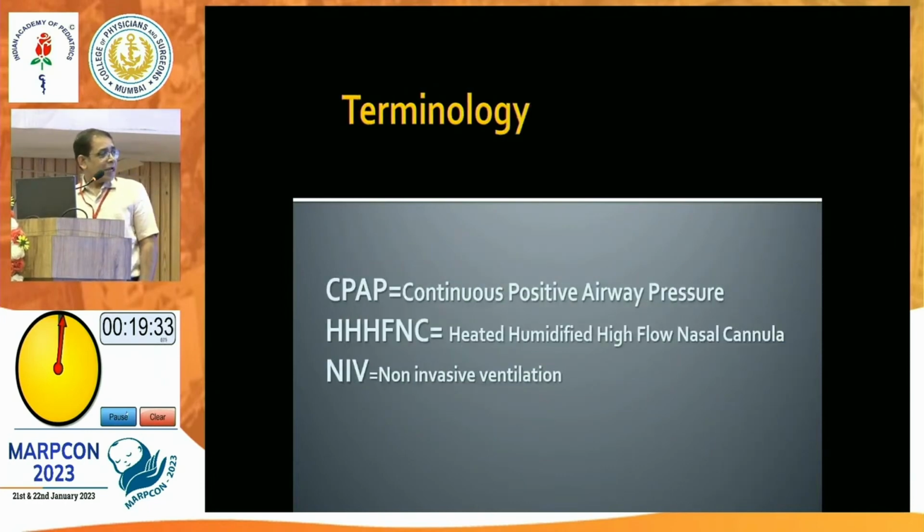All right. Coming to the academics, I was given the topic HFNC versus CPAP, but I have taken the liberty to change it to CPAP and HFNC because they are used in association with each other, not against each other. So both of these are modes of non-invasive ventilation.